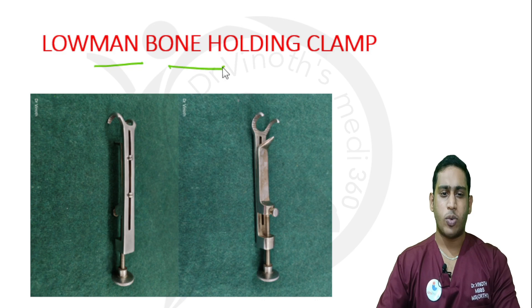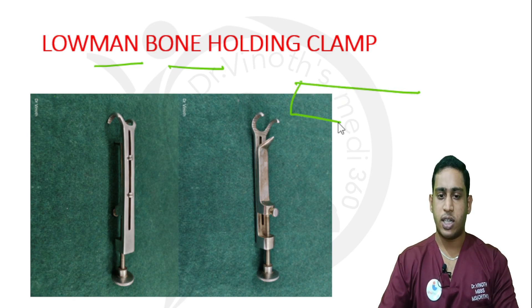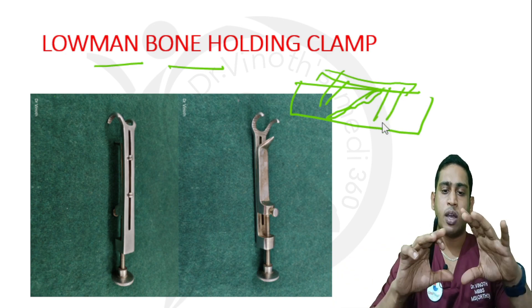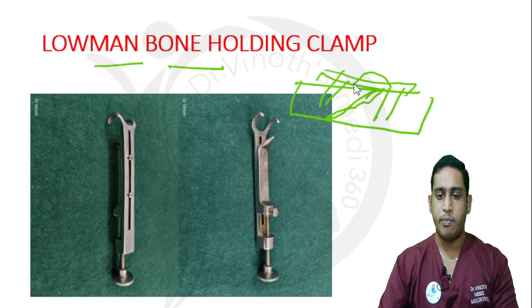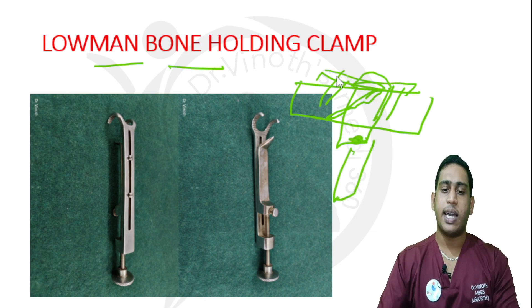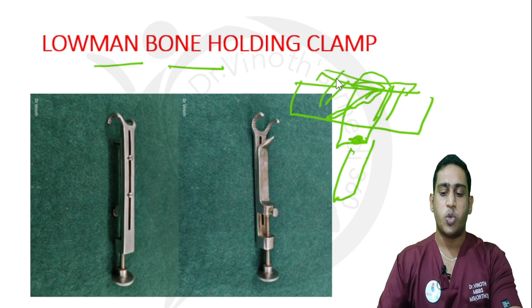The next instrument is the Loman bone holding clamp. As the name suggests, it is used for holding bone. When there is a fracture, I need to reduce it and keep it reduced so I can apply a plate. I can apply the plate only if the fracture is stable after reduction. So to maintain the fracture in reduction, I apply this bone holding clamp, which holds the reduction so I can easily fix the plate to the fracture area.